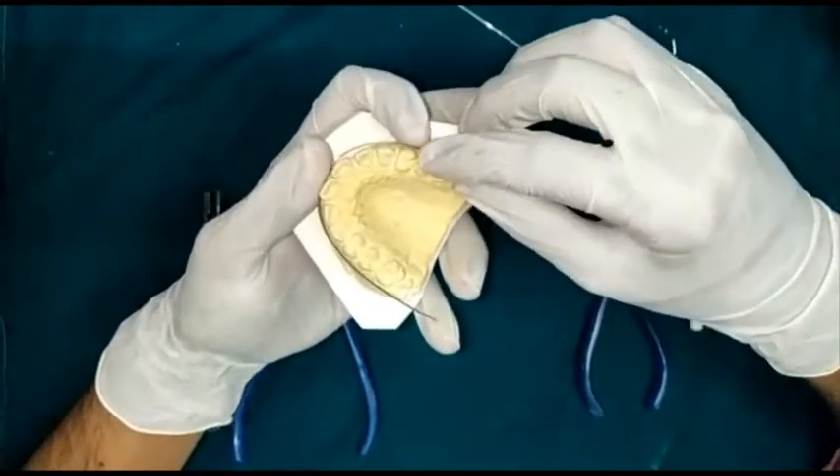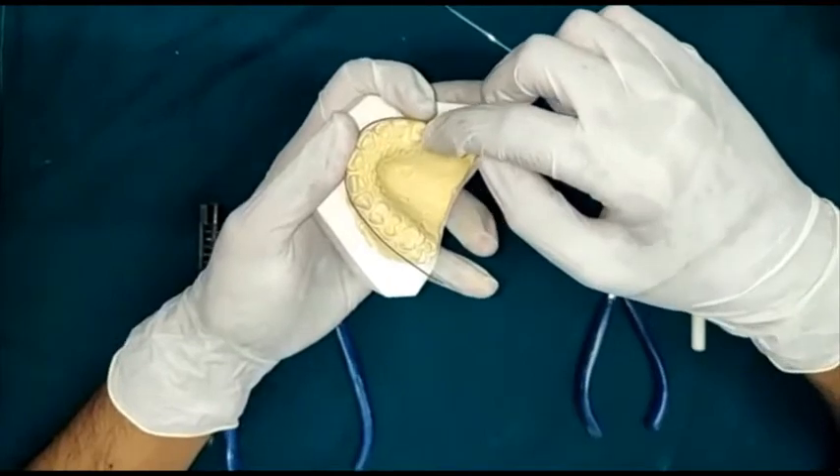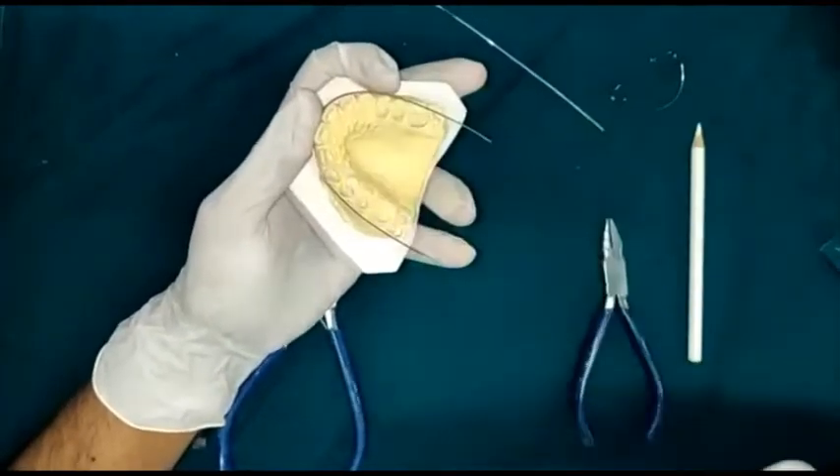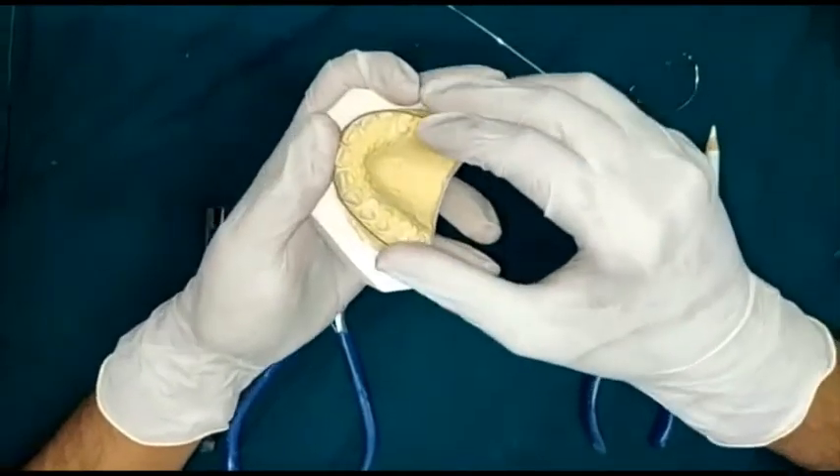The long labial bow will run from the first premolar to the first premolar on the other side. In extraction cases where the first premolars are extracted, it will run from the second premolar to the second premolar.